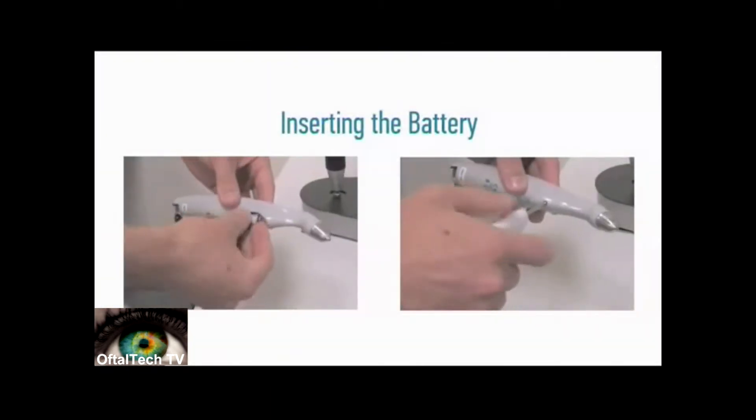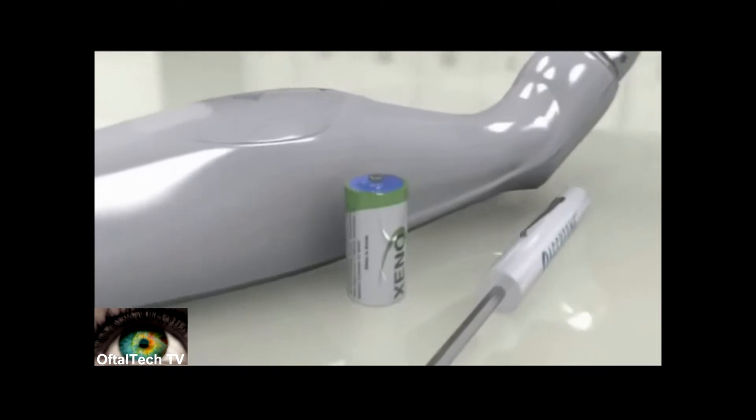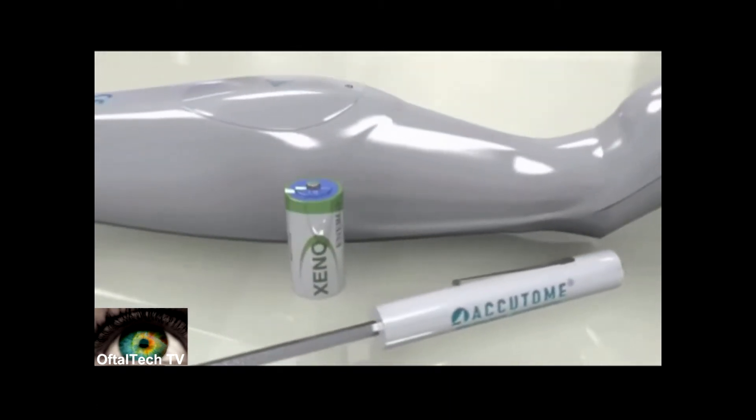Inserting the Battery. When you first unpack your AccuPen, the 3.6V lithium battery must be placed inside the unit.